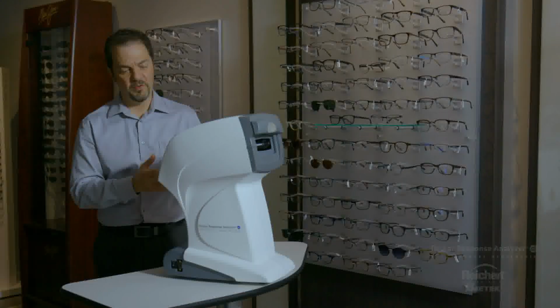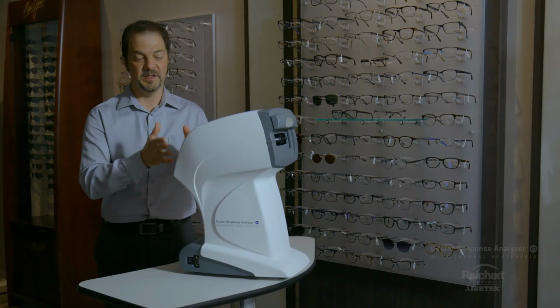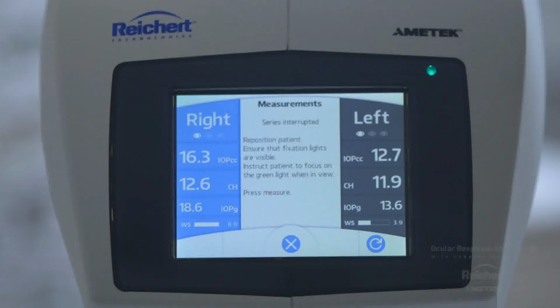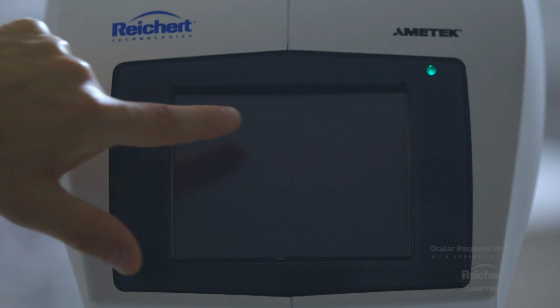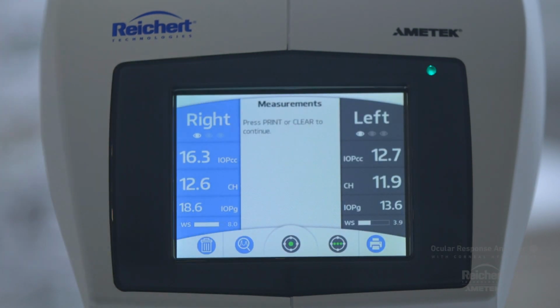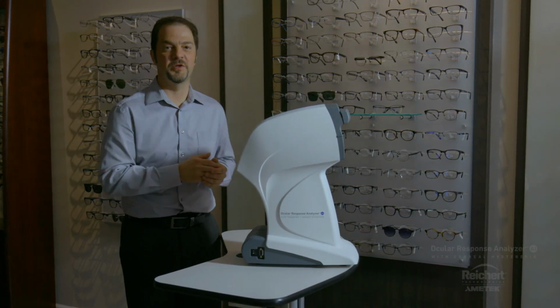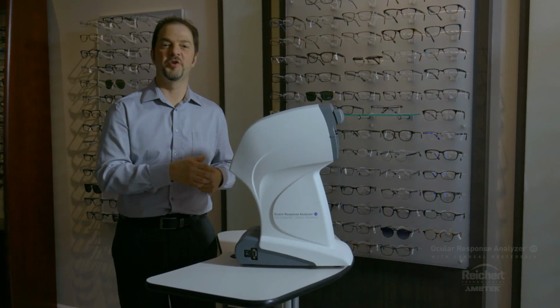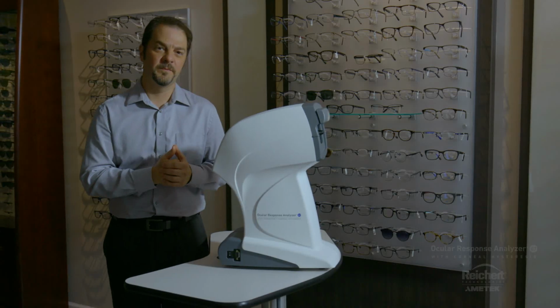No additional adjustments need to be performed. I think it's also worth mentioning here that this instrument has a sleep mode. If you walk away from the device and leave these values on the screen, after 5 minutes or 10 minutes, whatever you have it set on, the screen will go to sleep. When you wake the instrument up by touching the screen, if you've left data on the screen, it's going to tell you need to print or clear this information. And that's built in as a safety function so that you don't sit another patient down in front of the instrument, take a measurement, and then begin averaging their measurements with the previous patient's measurements.